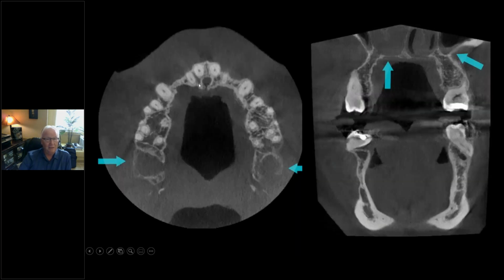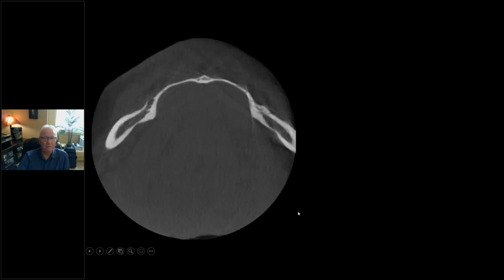First of all, the gentleman had just received 3rd molar extractions, top and bottom. You can see the extraction sites for teeth 1 and 16. In the thin slice data as we're going through it, we also found a lot of inflammatory change in the right nasal cavity, so we put arrows on it and report it in our report. But here's the freaky thing. This is the axial view about midway through the mandible. The mental foramen is sitting just about here, and you can see it on this side. Well, that doesn't look normal to me.